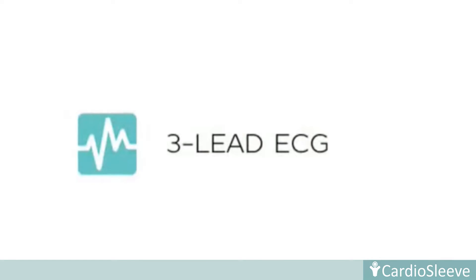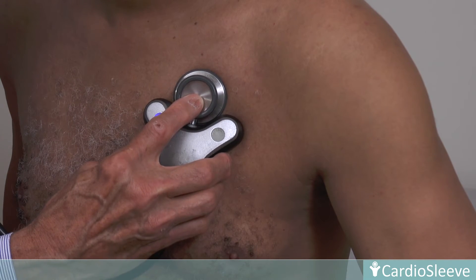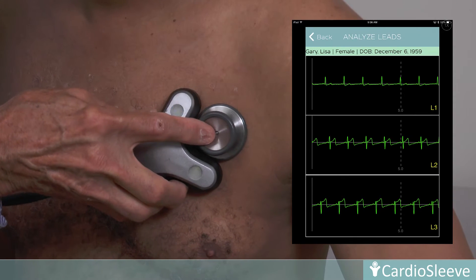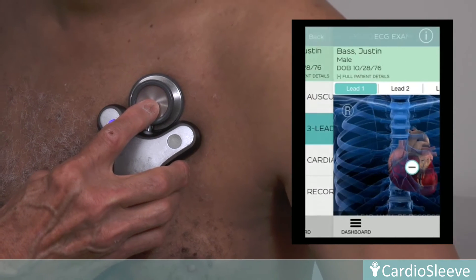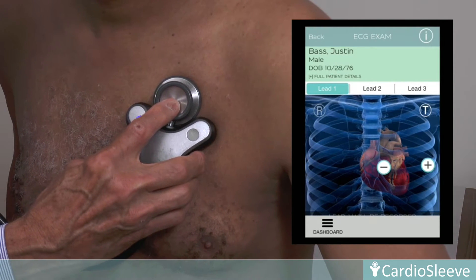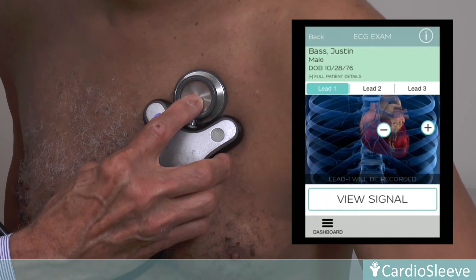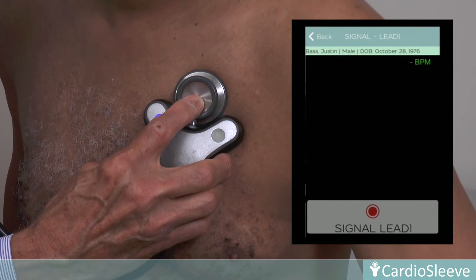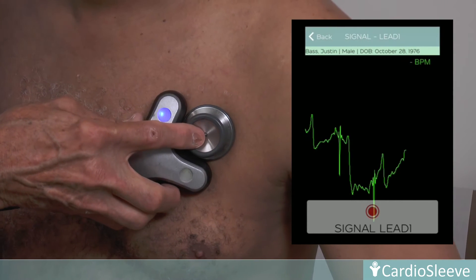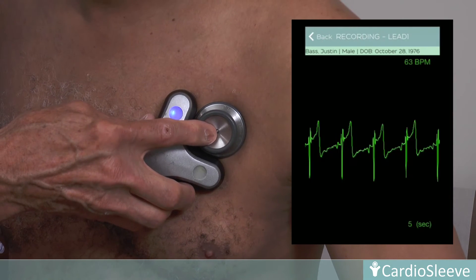CardioSleeve dry ECG electrodes record high-fidelity ECG at leads 1, 2, and 3. To begin, a chest illustration displays the proper CardioSleeve placement for a specific lead recording. Once the device is properly placed in lead 1 orientation and view signal is pressed, a full-screen ECG tracing is displayed. When a satisfactory tracing has been acquired, the record button is pressed. This process can be completed for leads 2 and 3.